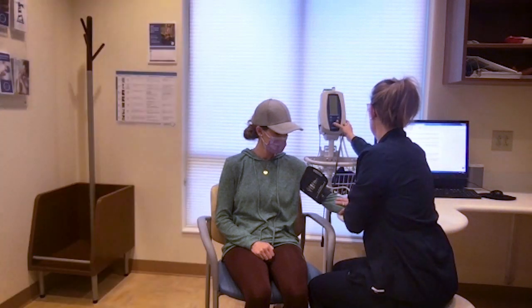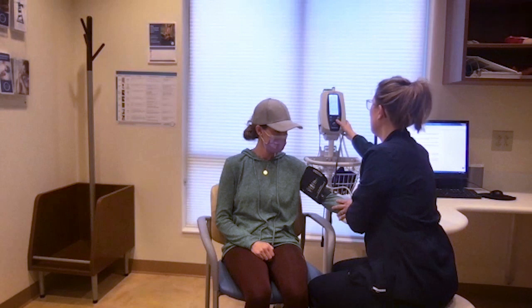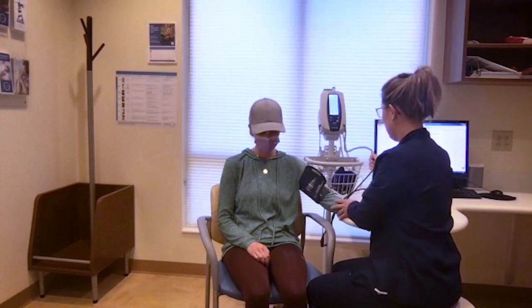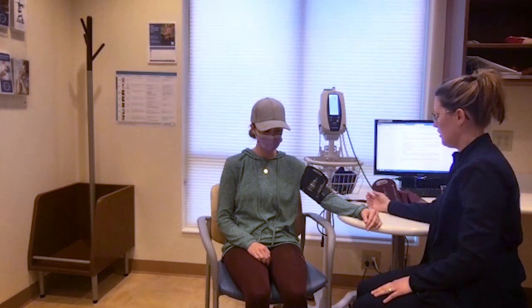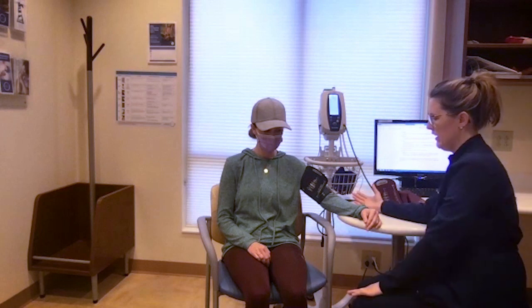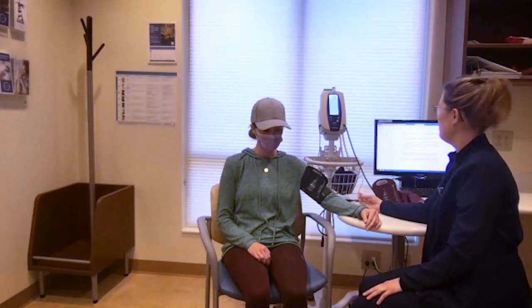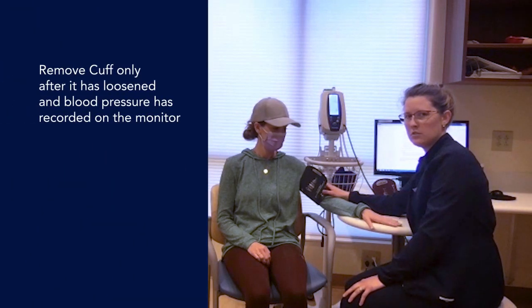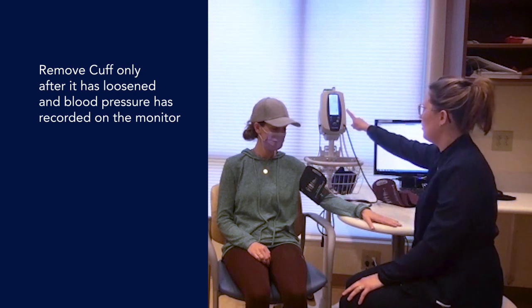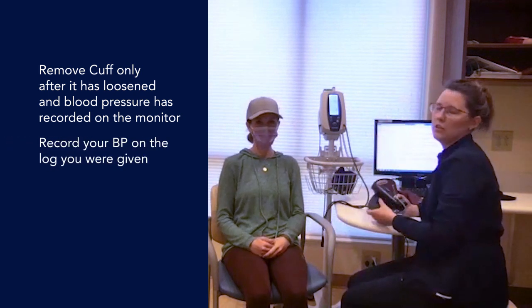When we get the blood pressure, most of you are using an automated cuff at home, and we use this here in the office as well. She's going to sit quietly — see how her arm is. We want to make sure it's at a level and not hanging down, because that can also affect the blood pressure. We're just sitting quietly right now. We want to make sure that the cuff is completely loose before removing it and that your reading is up on the monitor. Once you have that, you can remove the cuff and record your blood pressure and pulse on your blood pressure log that you were given.